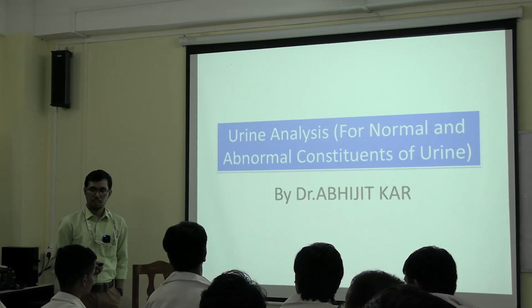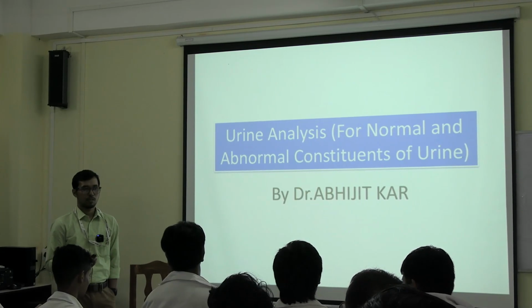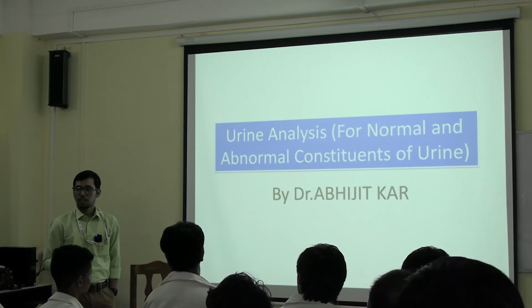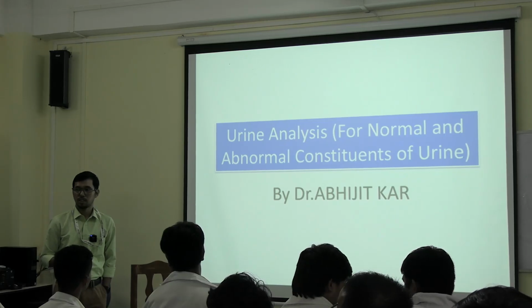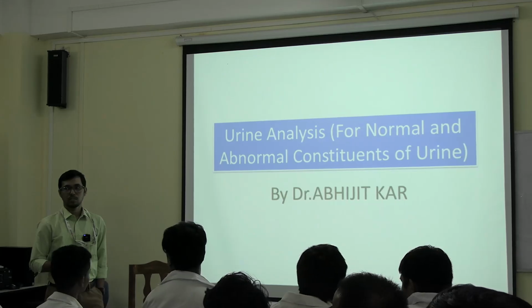Okay. What are normal physiological changes that can be found in urine? Red color, when there is blood mixing, or epithelial lining of the urine. Okay, these are abnormal things. Normal physiologically, it will get darker in summer season if you don't drink enough water. And if you drink too much water, it is white or yellow.